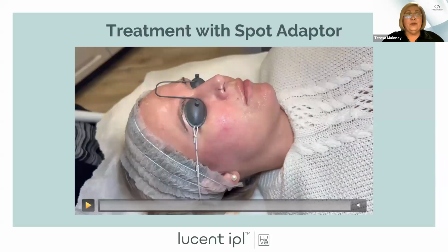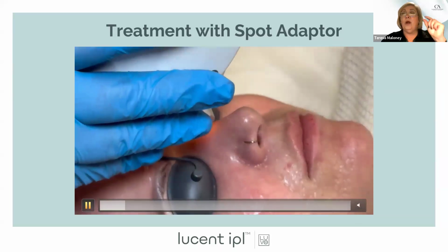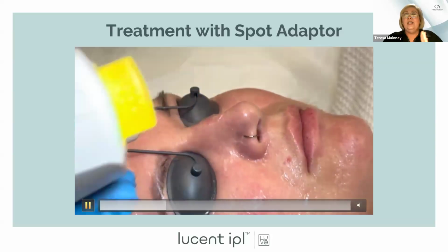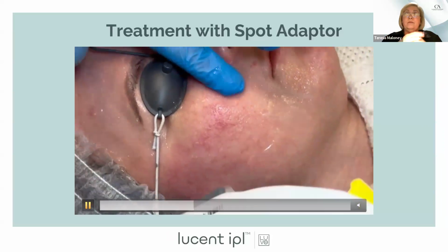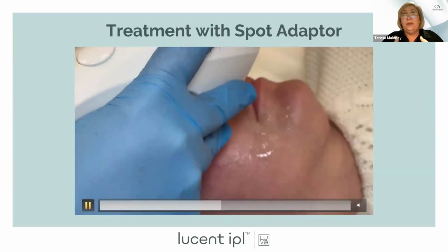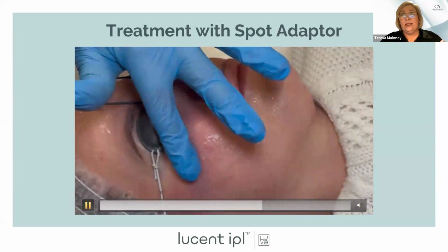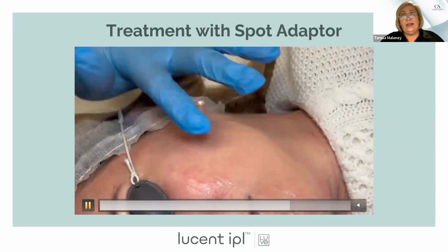So then when you're doing the treatment, you put on the little square, a very little gel. And what I do is I take gel and I put it on my big sapphire, and then I put the little one, the 12 by 12 one on. Big sapphire comes through to the little one. Now, it's hard on screen here to show that some of these vessels were just disappearing, but don't overtreat. Like I said, 2 pulses max. Review them in 3 to 4 weeks. See what you cleared up and could get nice results with it. But it's just targeting. Very little gel.